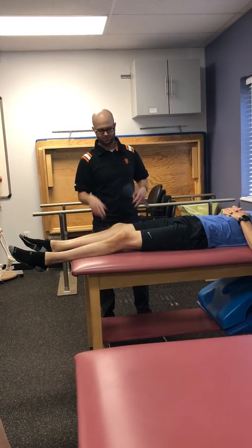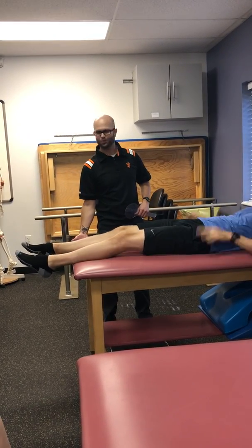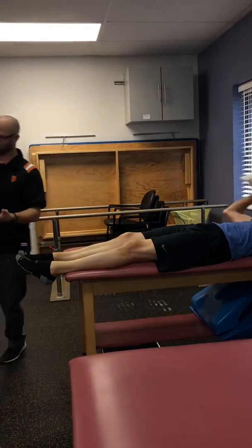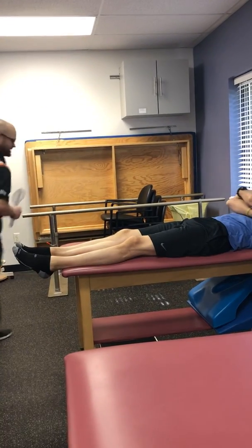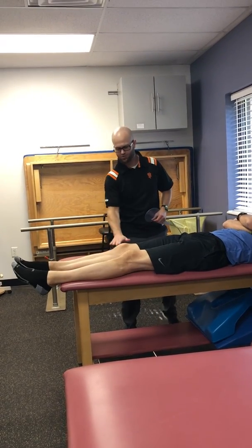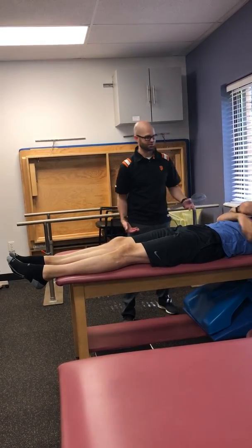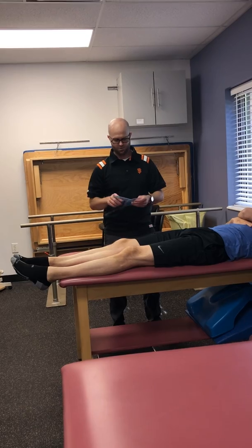Now to make it easier for him, because he's ridiculously long, I can give him a little bit more support. I'm going to have you scoot to that side. Now to be safe, I would want to come over to this side, have him scoot over here, and then he's not afraid. And then I come all the way back over here, and it's a pain, but patient safety is number one, okay? So now he can go through that motion without having to really engage his hip flexors as much, because he's supported by the table through the majority of the motion. So I'll have you do it again. Let's see what happens. Good, okay? Now we're going to get our measurement.